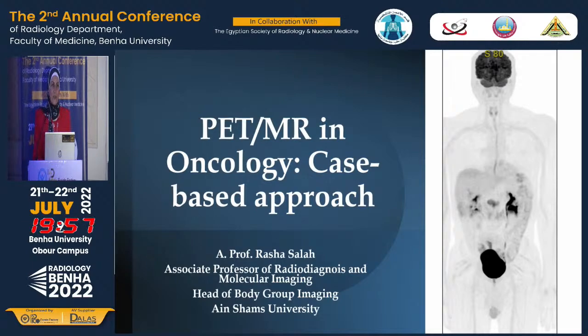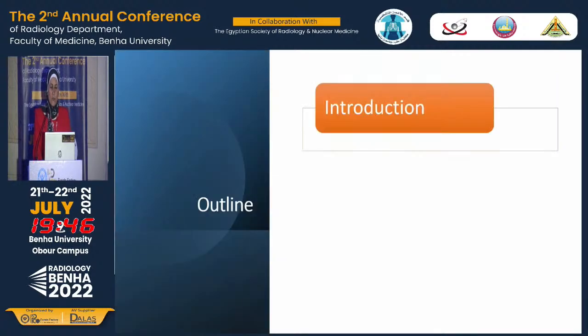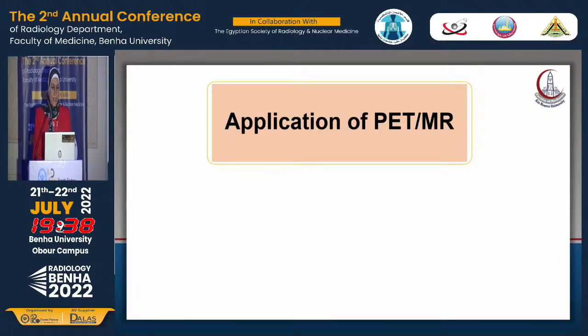Today we will talk about a new era in radiology, PET MRI in oncology, using a case-based approach. This is my acknowledgement. We are going to have an introduction about PET MRI, and we will talk about the technique, and we will present some of our real cases.